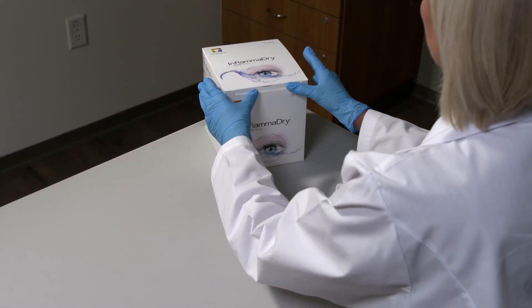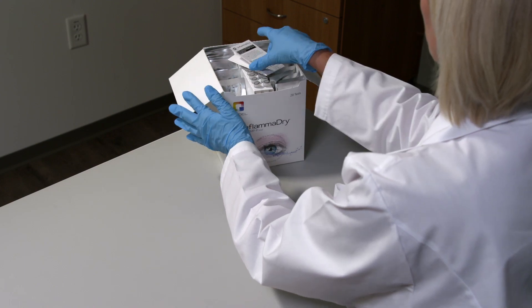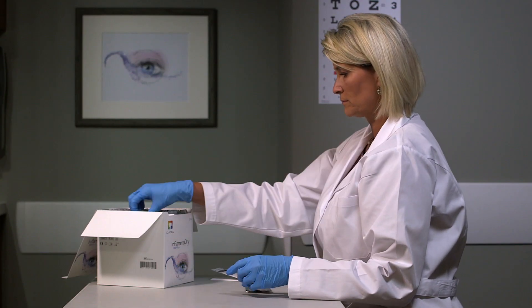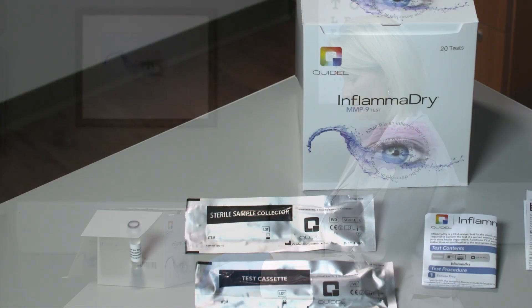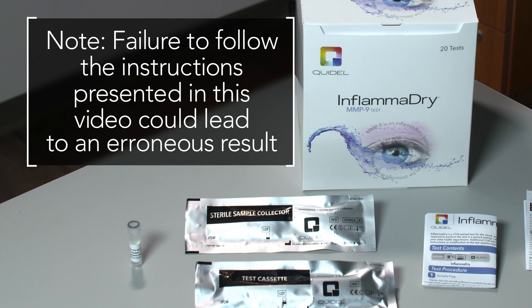InflammaDry external controls are to be used only with the InflammaDry test. They are intended to verify that the test reagents are working and that the test is correctly performed. Please note that failure to follow the instructions presented in this video could lead to an erroneous result.